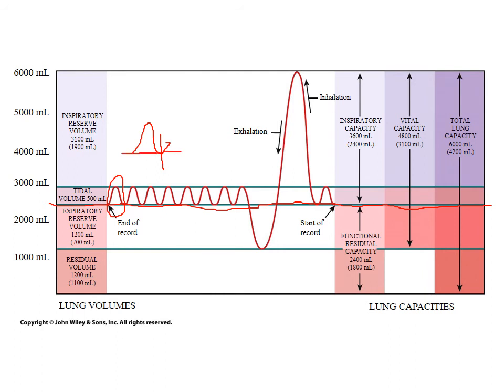So the baseline, again, is this little line here. I'm going to try and do a better job of drawing that because I think I got it all over the place. But this line right here is going to be a dividing line between the normal breathing and the one respiratory cycle and the next. So the last two capacities are dividing the lung between those two.